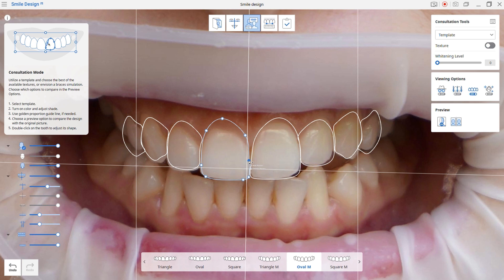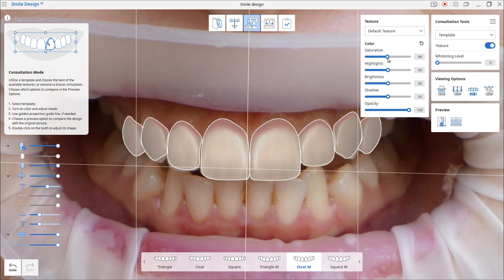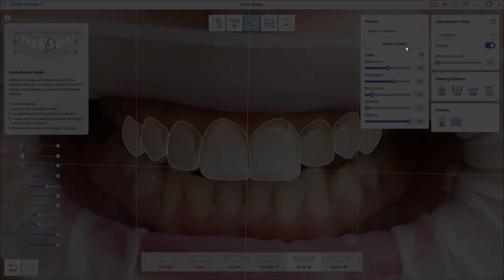Left-click to add a point and right-click to delete a point. Next, you can fill the template's texture by choosing one of three options. First is the default texture, which can be edited. If you use natural texture, you will get the shade and texture closest to the image you are working on. If there is an error detecting the teeth's texture, click texture editor to manually adjust.